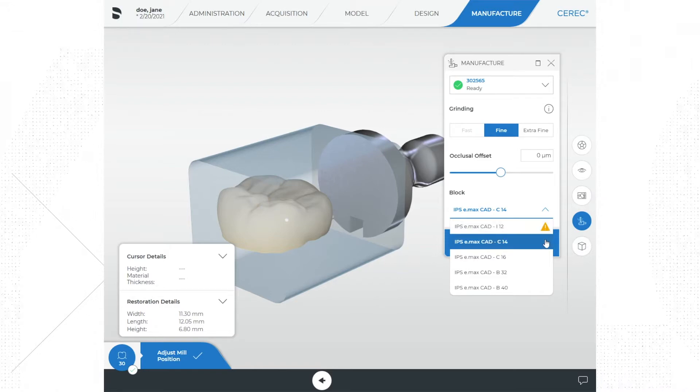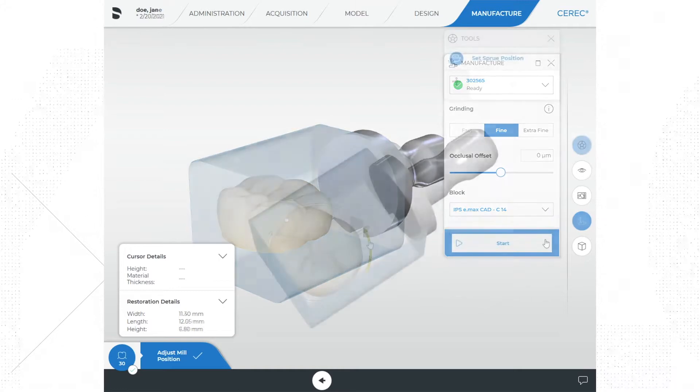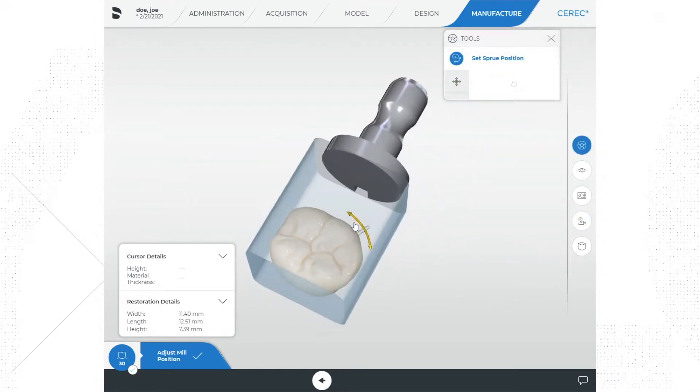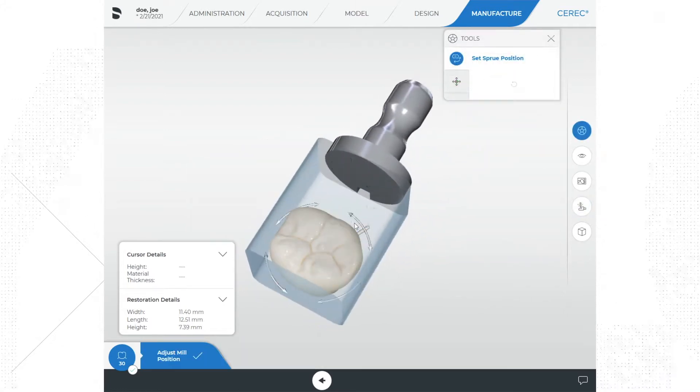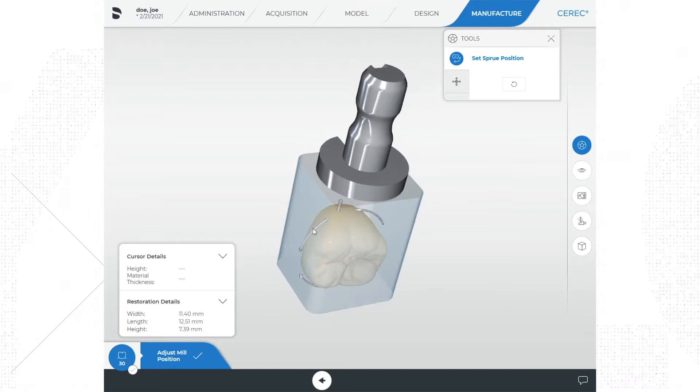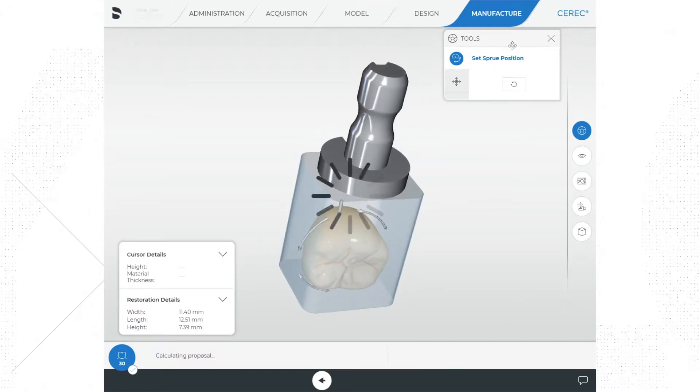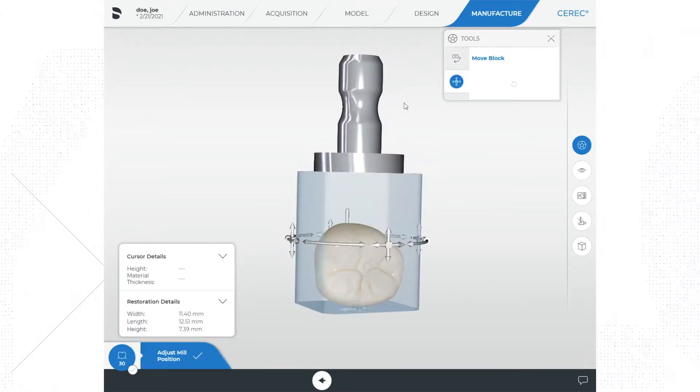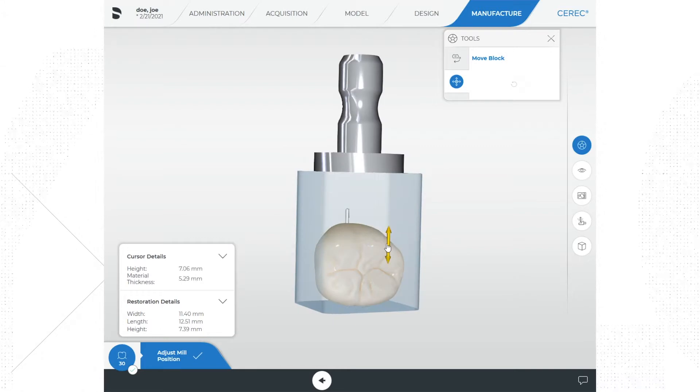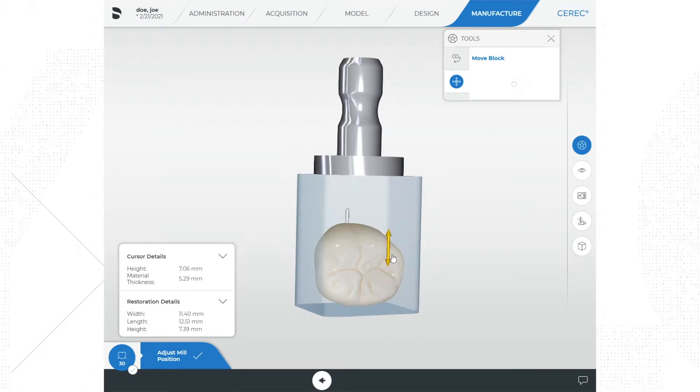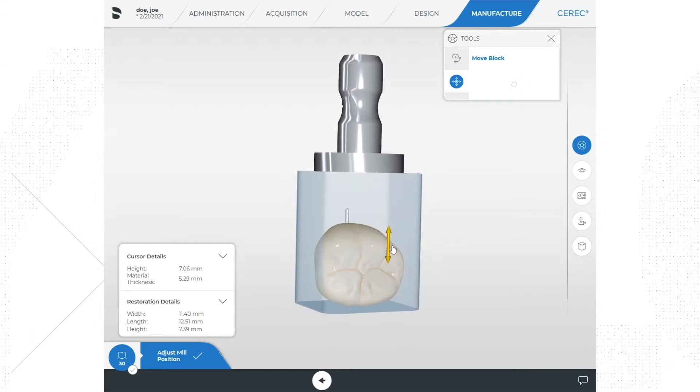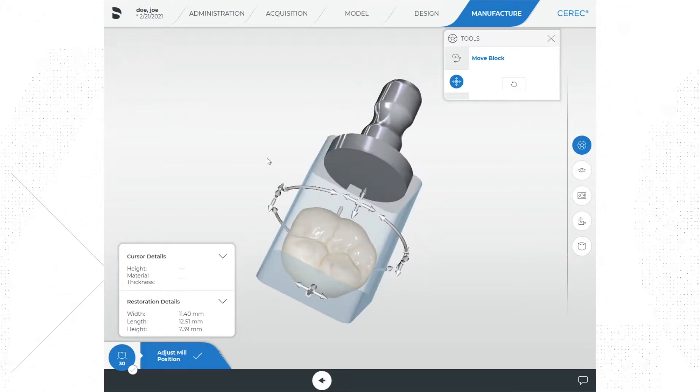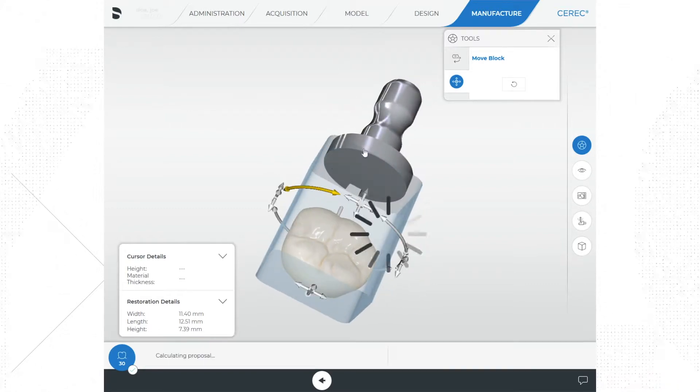The last thing we do in this phase is adjust the mill position. This tool is used to position the sprue and to locate the restoration in the block. The move tool allows the operator to position the restoration within the block. This tool is useful for polychromatic real life or other multi-colored blocks.